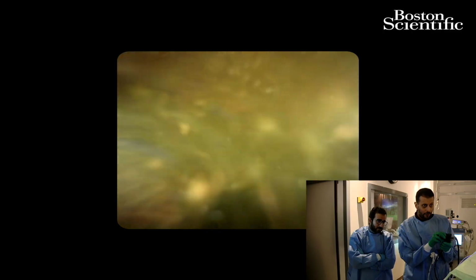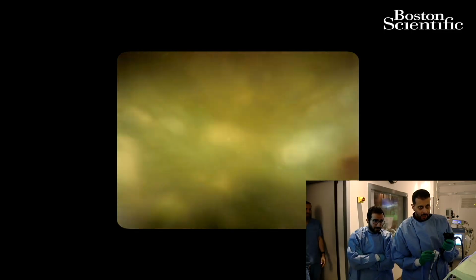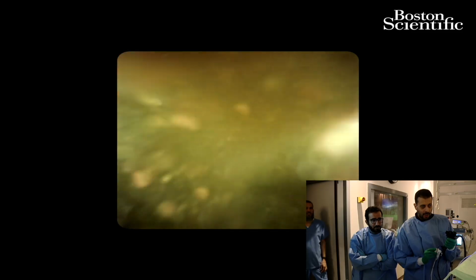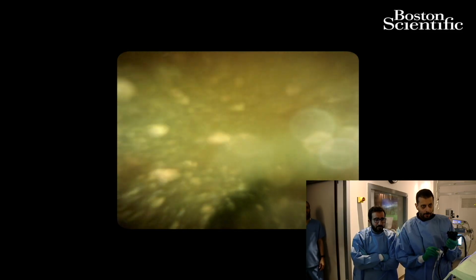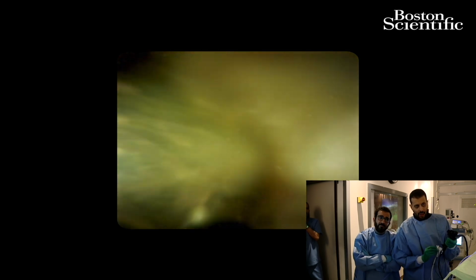So this is a very nice case. We went through all the challenges of EHL in elderly patients: J-shaped stomach, advancing the catheter into the bile duct. I think it gives you more real-time use of cholangioscopy. And we're very happy to participate in this. And thank you so much. And if you have any questions, I think we have a minute left.